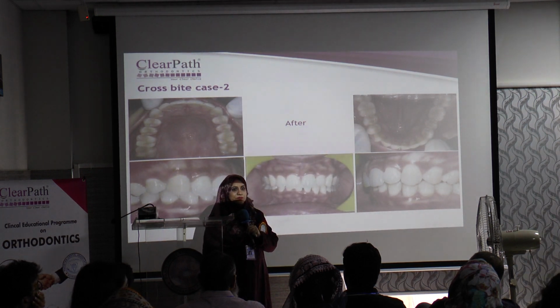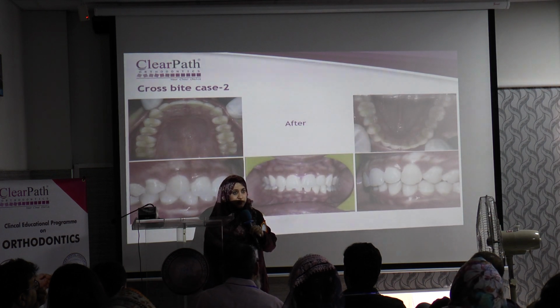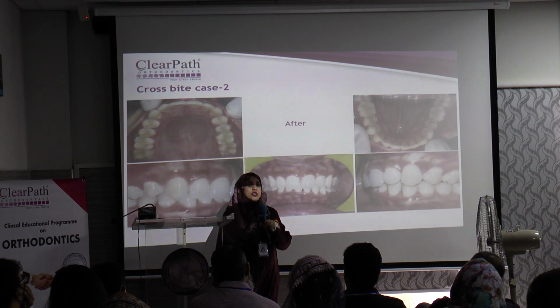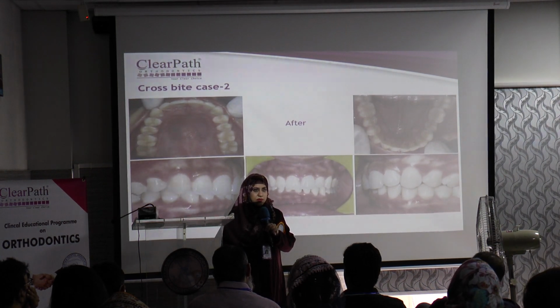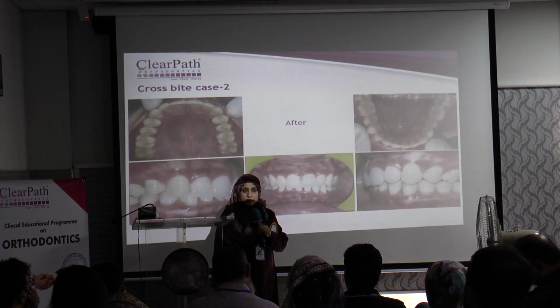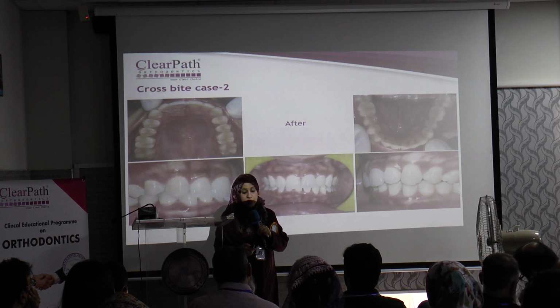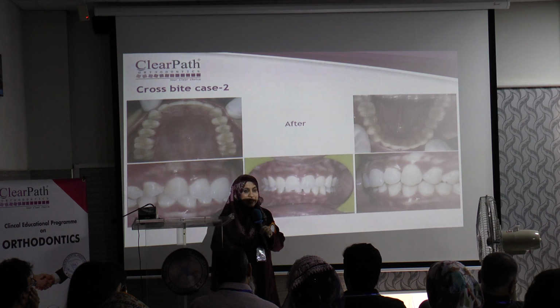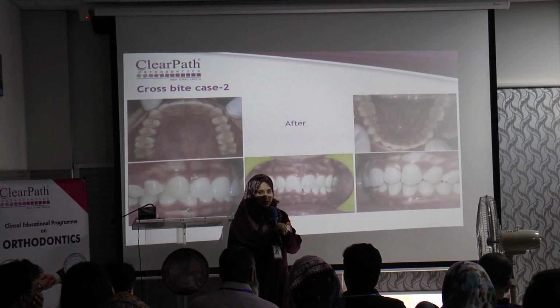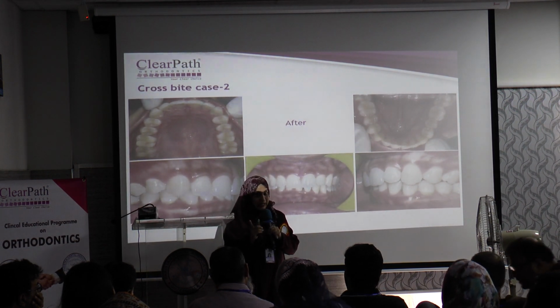Can aligners have so much retention that they hold the elastic straight? Yeah, and we also give attachments for the retention. If we think the retention is not enough, we also give attachments. Different kinds of retention will be needed for a spacing case, if space has been given. It depends. If you have given a very wide space, that's different. Usually fixed retention is indicated for the diastema. But again, it depends on how big the diastema was, and whether you have done a frenectomy or not.